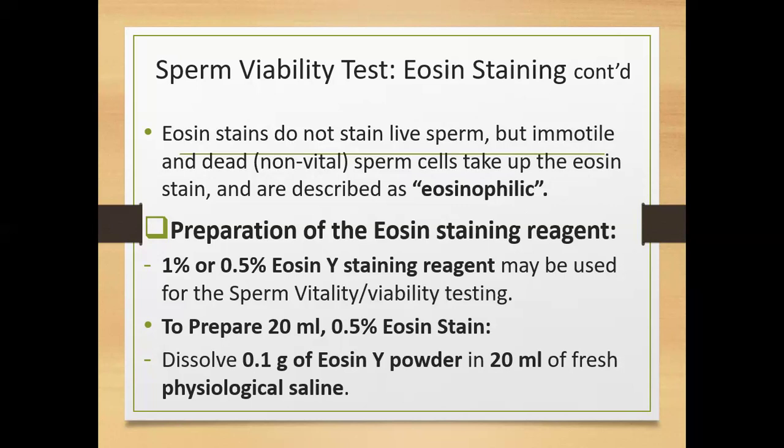And then they all pick up the stain and appear dead. Remember we said that once the cells pick up the stain, it means that they are dead. But because you use water as a medium, water will move into the cell, kill it, and then the stain will also stain it, so that all your viability tests will show positive.